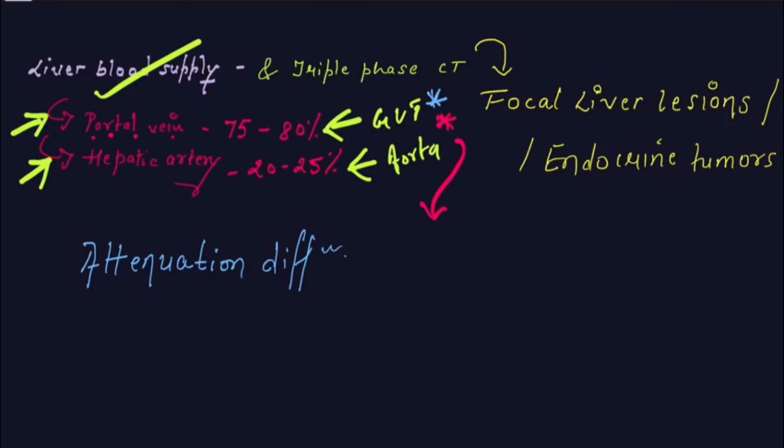In this case, to supply the needs of the liver, the hepatic arterial flow increases, and so the hepatic artery becomes hypertrophied, and also the hypervascular neoplastic lesions of the liver, for example HCC, take their blood supply from hepatic arteries. Okay, keep this in mind, because that's very important when we discuss the triple phase CT protocol.